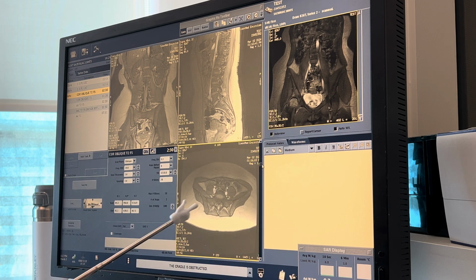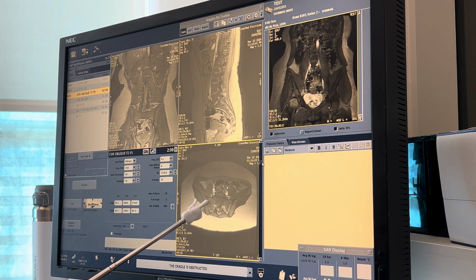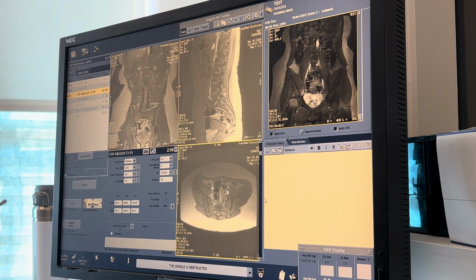We're going to look for those SI joints, sacrum, ilium, SI joints right there about to form, so go up one more. That's a great image, SI joints, those black lines right there. One more. Even better, keep going. Yeah, I would say that last one. Do we need to increase the FOV on this one to get everything, or it doesn't matter if some of the... No, that's just the localizer.